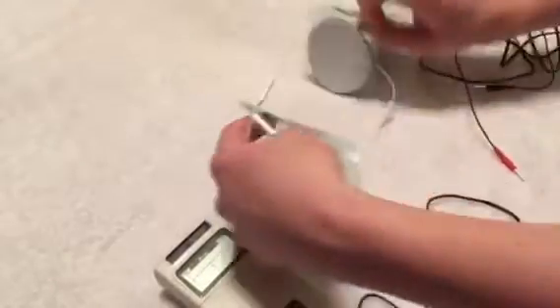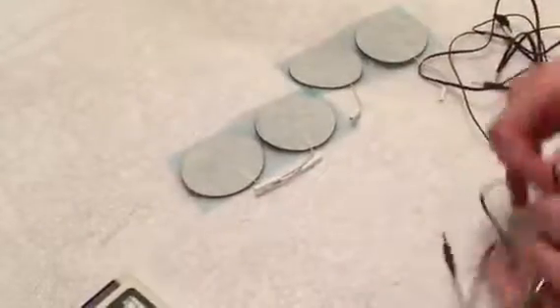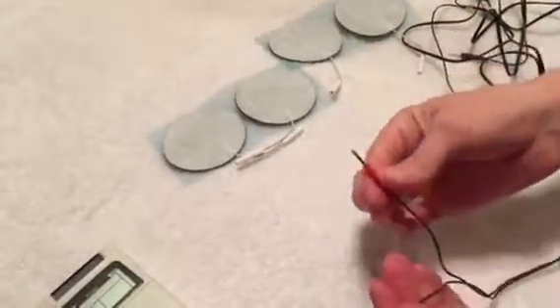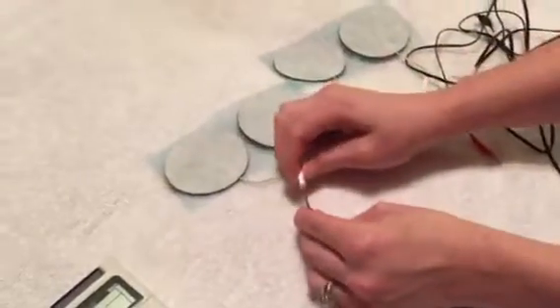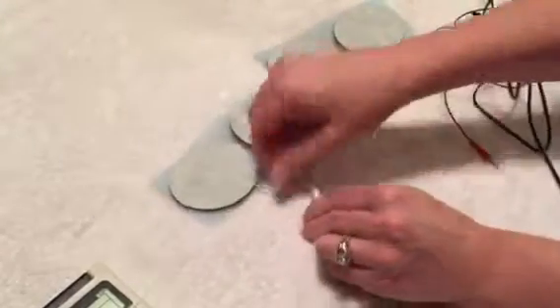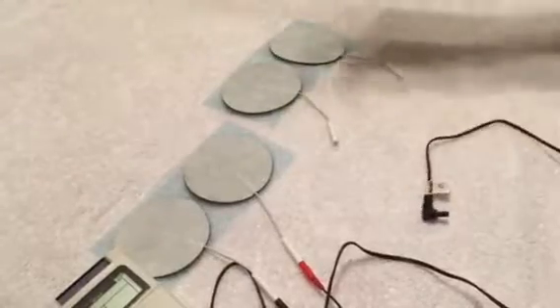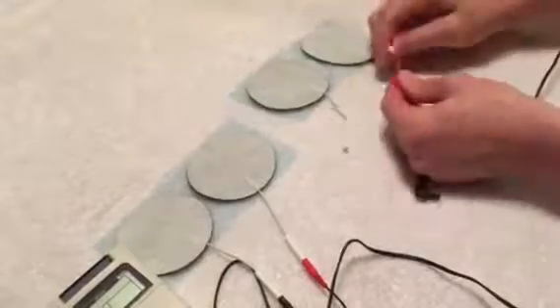To open up the electrodes you can just pull off the tab and you're going to pull out four electrode pads. Each lead will have a red and black plug so you can plug those into the electrodes. The other lead wire also has two red and black plugs — plug those in.